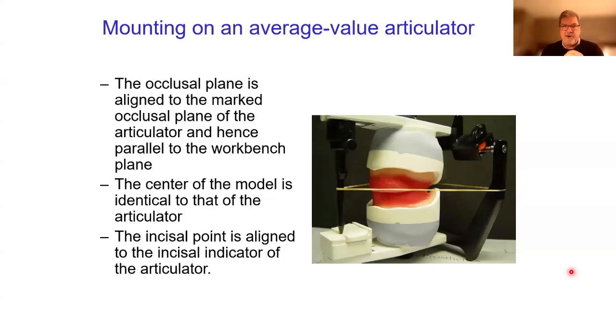That occlusal plane is matched to the occlusal plane of the articulator and parallel to the workbench. And the center of the model is identical to that of the articulator, so that incisal point is aligned to the incisal pin of the articulator. What I usually do is put a rubber band around the incisal pin here.